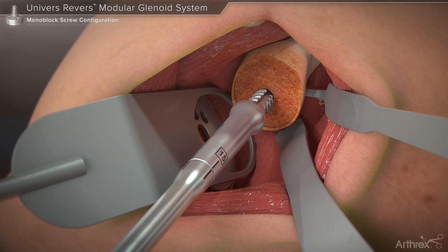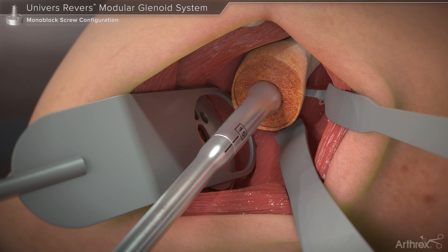The 15 mm tap length is selected and is attached to the manual driver handle. The tap is then used over the guide pin until its collar is seated flush on the prepared glenoid face. The tap and the guide pin are then removed.